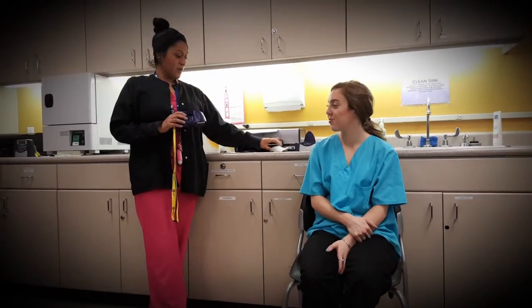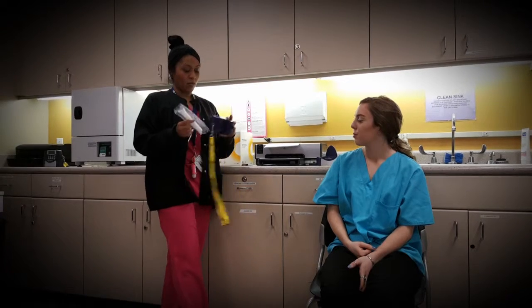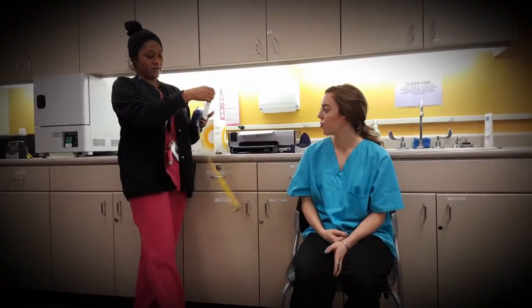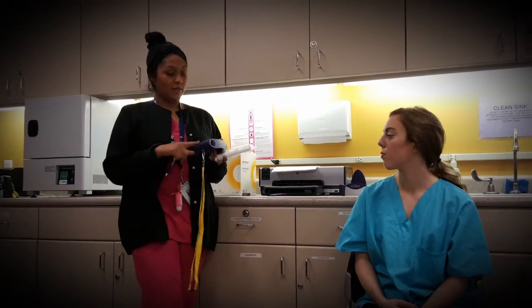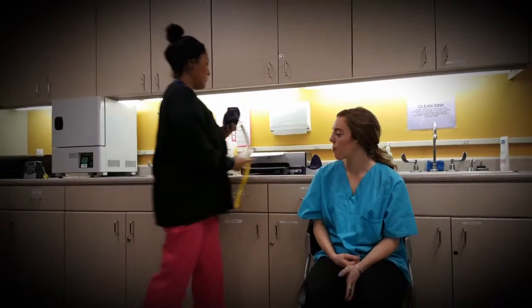After entering demographics, we give the patient the spirette and educate them on how to use it. This machine only works with its specific spirettes — every machine has its own mouthpieces. Once inserted, there's a little arrow showing how to insert it correctly. You are not going to touch the mouthpiece; only the patient touches it after their saliva is on it. Sometimes the machine needs a baseline reset — you cover the end once the spirette is in the machine, press enter, and it sets up a baseline.